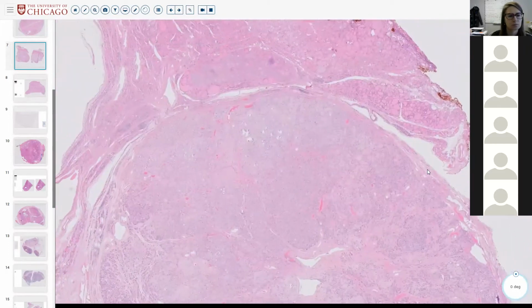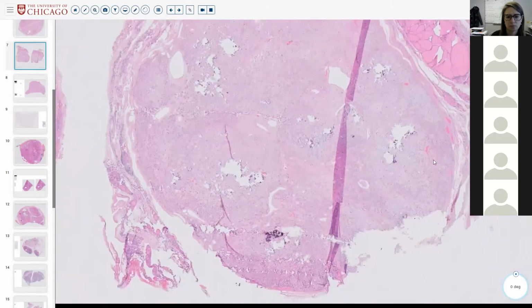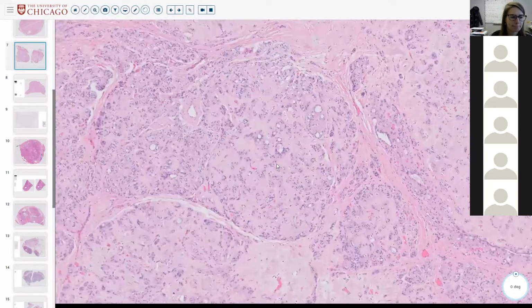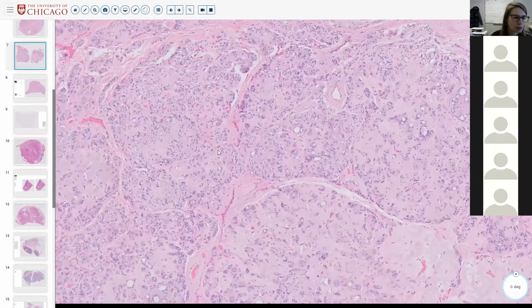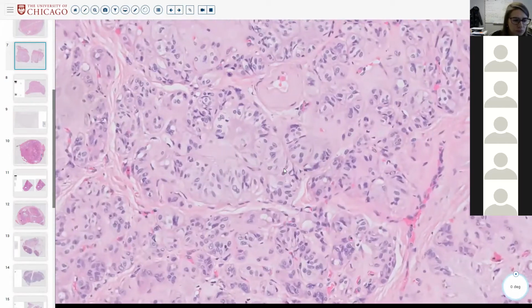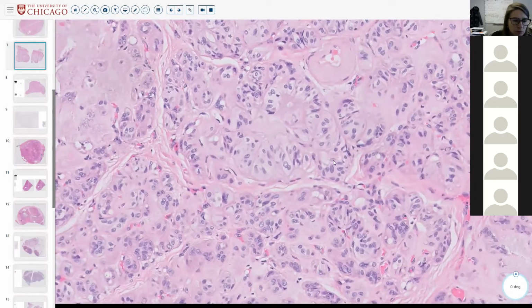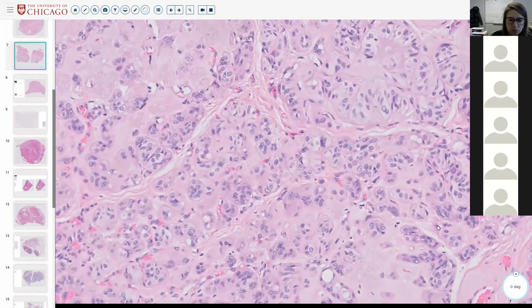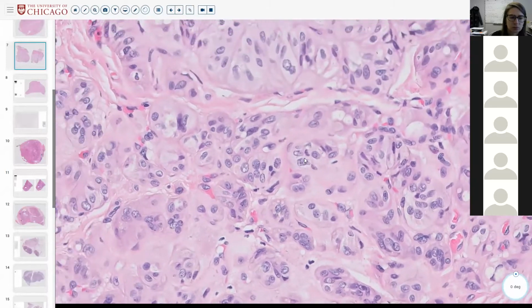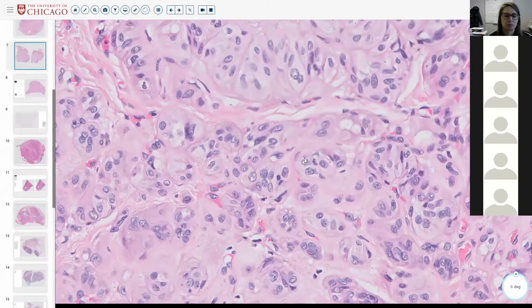I don't see much of the follicular pattern that we were seeing before in all of our follicular adenomas. It looks more pink, kind of lobulated, and it's giving me a hyalinized appearance. But it's not jumping out as concerning for nuclear features. The nuclei appear uniform, some maybe have nucleoli, but I don't see very prominent papillary nuclear features.